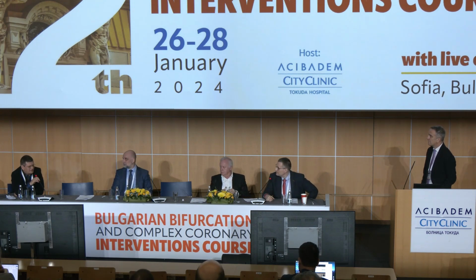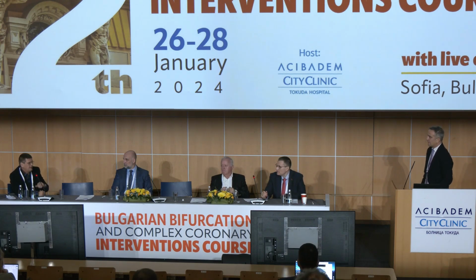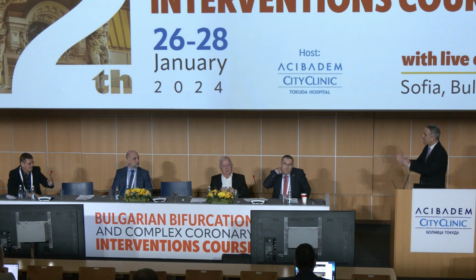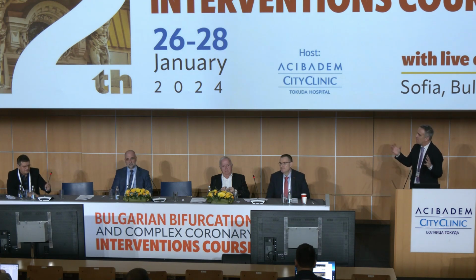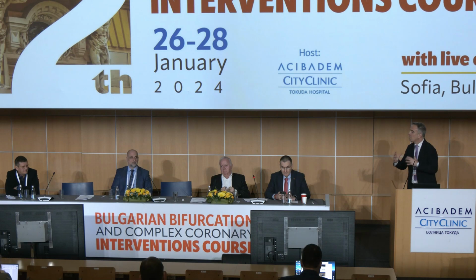You spoke about shield protection, but there is still one more kind of protection, the collimation. If you don't work on a full screen and you collimate the picture of interest, the dose reduces very rapidly. Yes, it's true, agree. So tweaking, collimation, and all this comes before the protection. Afterwards, we can put in additional shielding. But the thinking in the head to reduce dose before that, everyone should be aware.